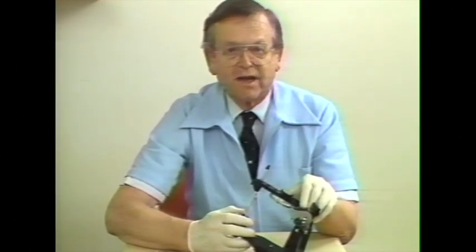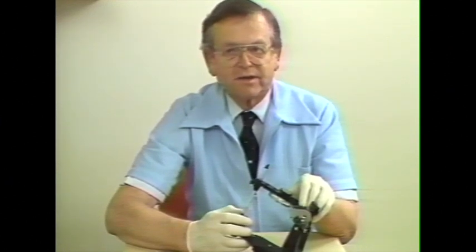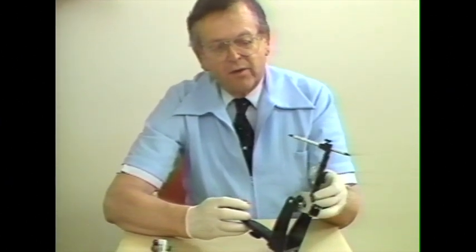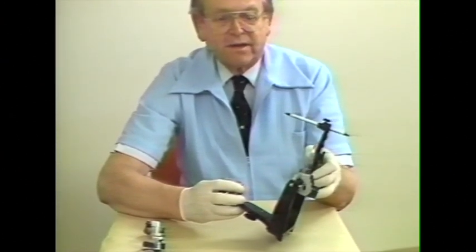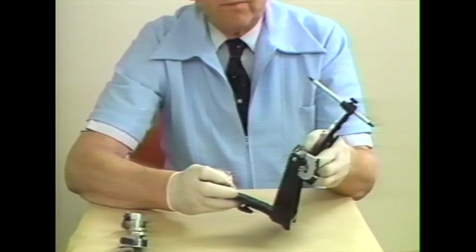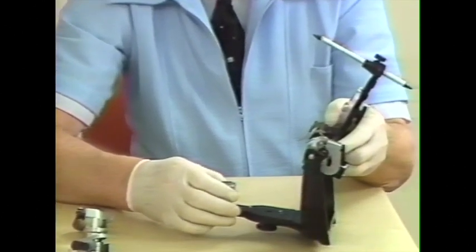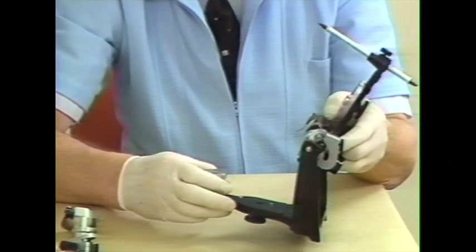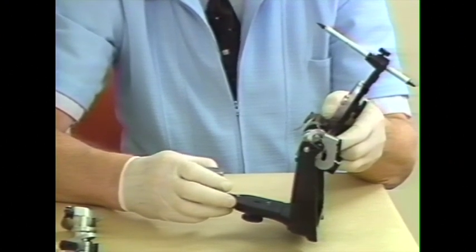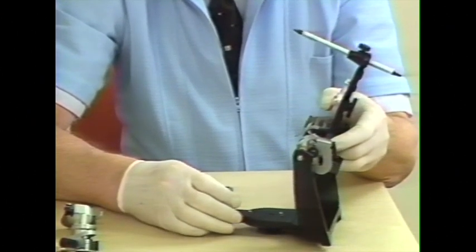The Hanau Modular Articulator has a number of features which allow the clinician to select the type of articulator he desires. First, it is an Arcon articulator, which means that the condylar elements are on the mandibular arch and the fossae elements are on the maxillary. This more closely duplicates the actual relationship on the patient.